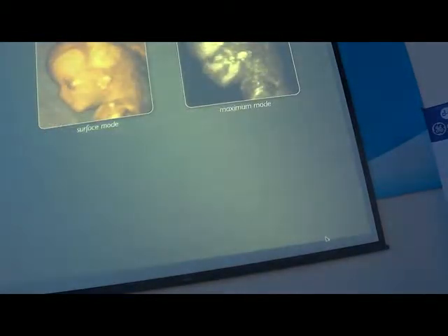This is the normal aspect of the face at 12 weeks of pregnancy, with the ears in a low position, which is normal at this stage. Here is the 3D image of the face at 12 weeks, showing the ears in a normal position. And this is the same head, but using another rendering mode, the maximum mode.